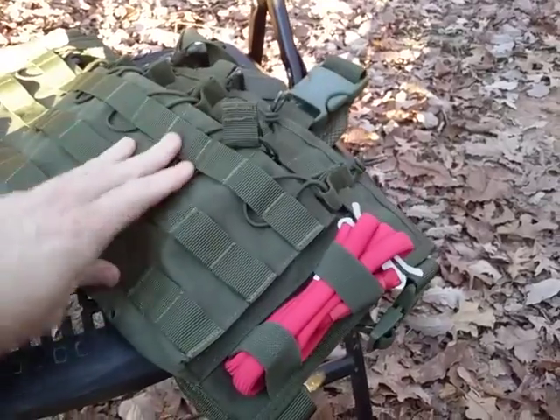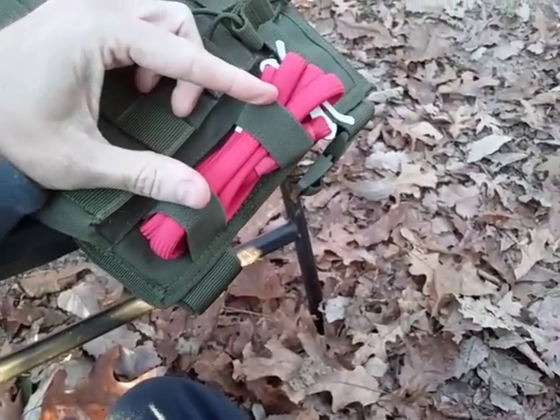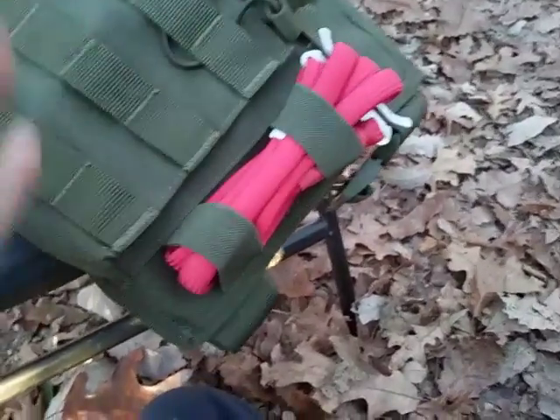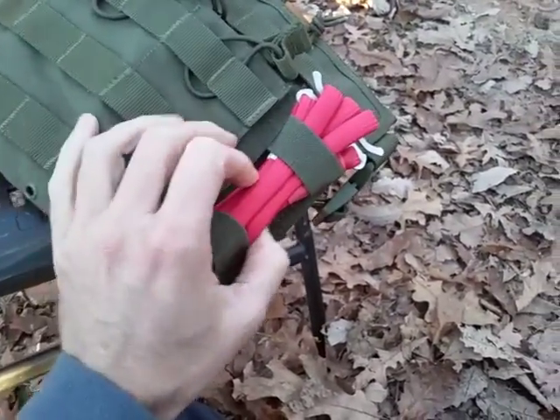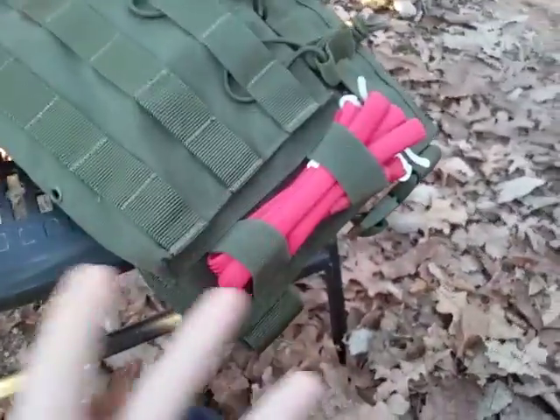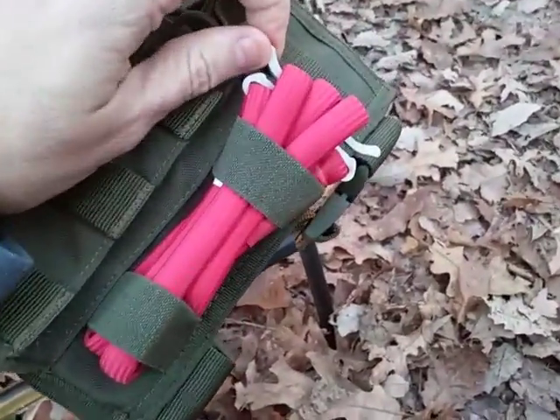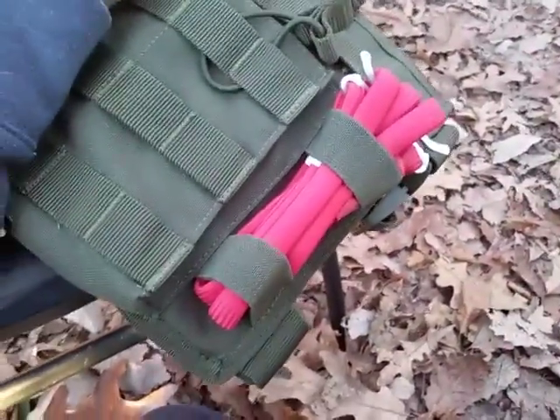So this is just on a standard plate carrier here that I borrowed from my buddy. As you can see, I just have it slipped in these little elastic bands. It's very small. You could probably put this in any kind of pistol mag pouch. It weighs around 1.5 ounces, roughly, I'm estimating. It's an aluminum type of hardware, and basically you just cinch down and you wrap, and there you go.